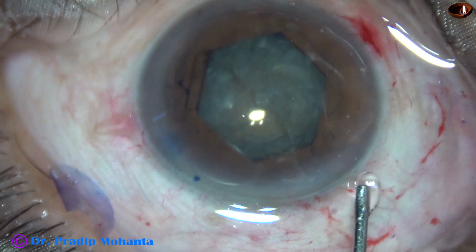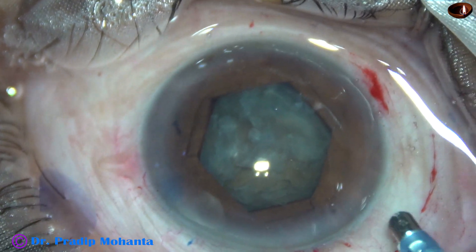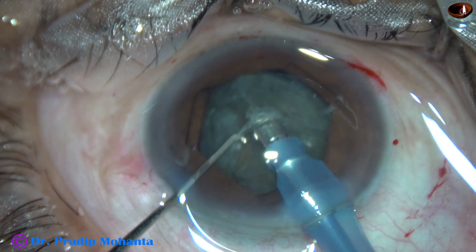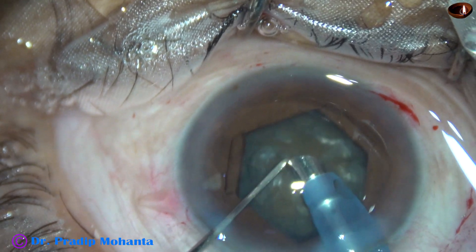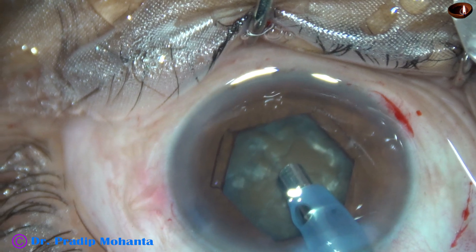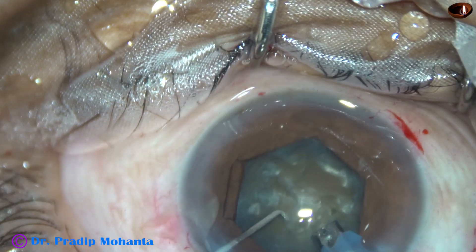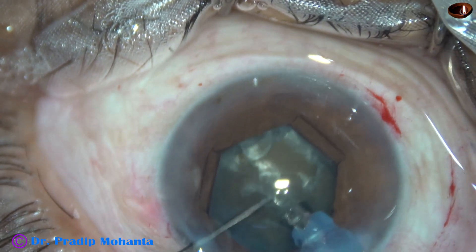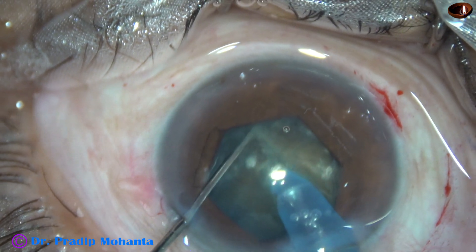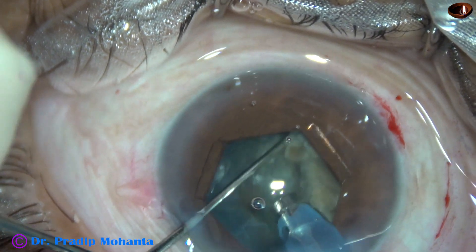Now is the time to introduce the phaco needle. The machine being used is the Oertli CataRhex 3 from Switzerland. The phaco needle goes in with bevel down and some superficial cortical lens matter is removed. The handpiece is then turned to make the bevel face up towards the cornea. In such cases, I do a direct chop of the nucleus — I call this technique 'submarine chop.' The tip goes through the substance of the nucleus, making a tunnel at a deeper level. As it reaches near the opposite equator, the chopper is used to make a nice crack.